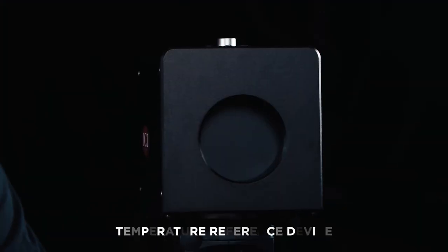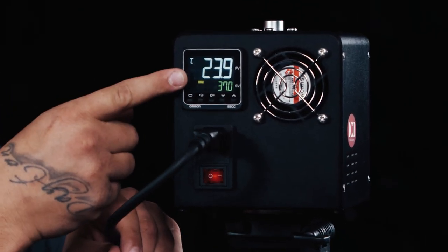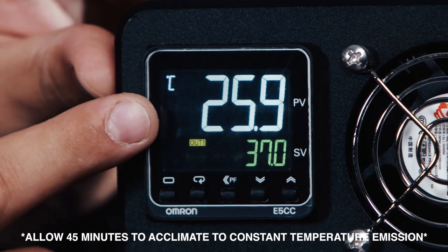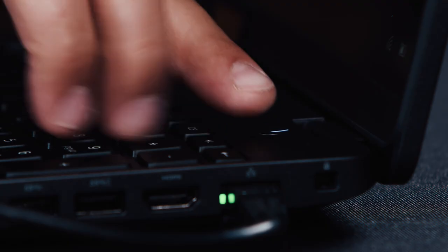Now that we have set up all of our camera and temperature reference device, let's power them up. With the temperature reference source, flip the switch on the back to power on and then allow 45 minutes to acclimate to a constant temperature emission. The temperature is set at 35°C to 37°C. Now simply turn on your computer by pressing the power button.